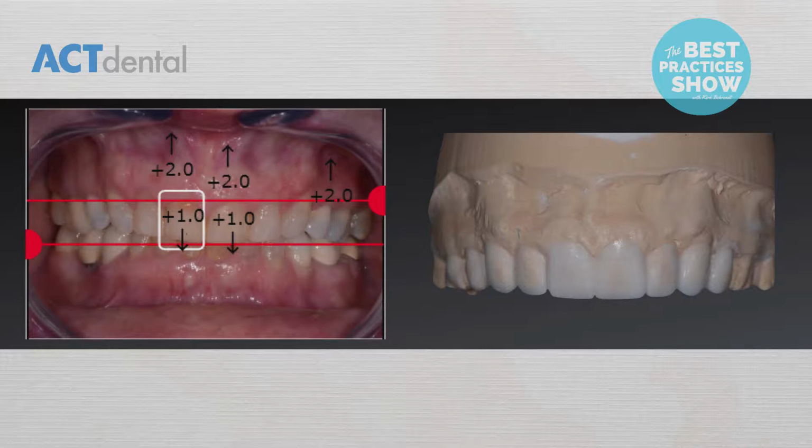Here's the other thing. When you do a wax up, however your treatment plan is going to go, and again, this isn't about doing 12 teeth per arch. You might only be doing the centrals. Maybe you're doing 4 anterior teeth. Maybe we're going around the corners, bicuspid to bicuspid or molar to molar, or whatever it is. However you as the doctor determine that you want to sequence this treatment, only wax up that segment, because then that segment will be accurate when we go to do the treatment on the patient.